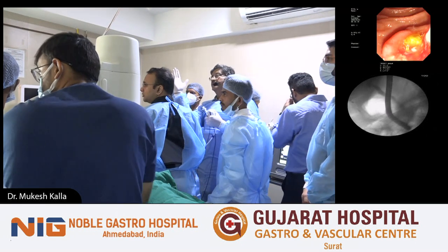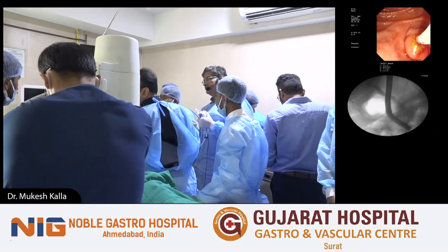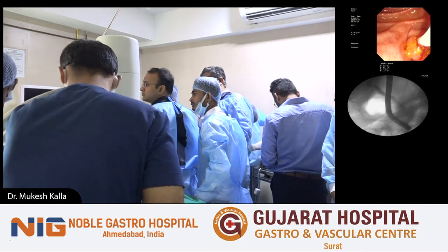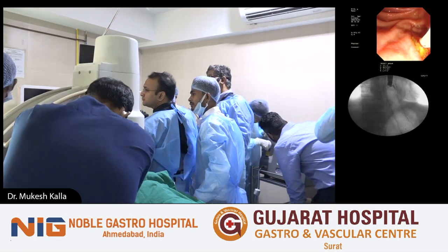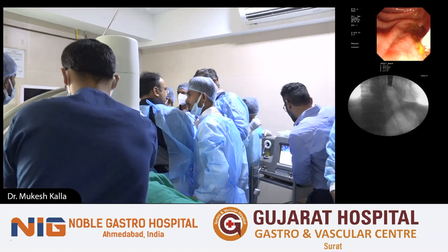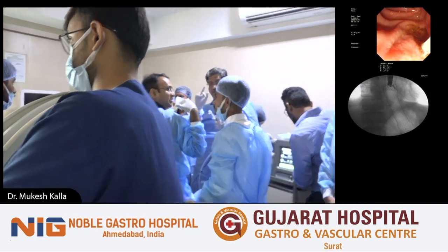But when we read between the lines, you will see that re-intervention was required in 16% of patients because of the large stones. In a single sitting, it is very difficult to take out all the stones. Conversion to surgery happened many a time when two attempts of laser lithotripsy did not succeed. So they asked their surgeon colleague to go for laparoscopic surgery.